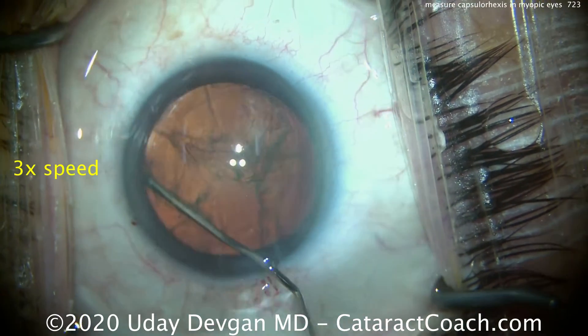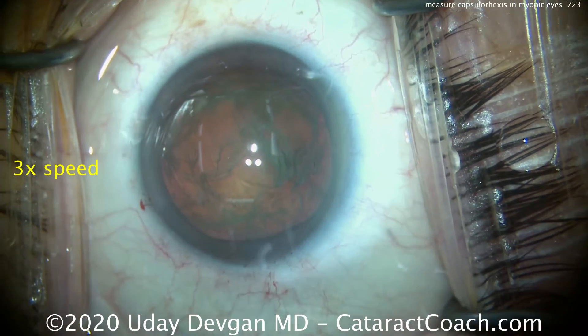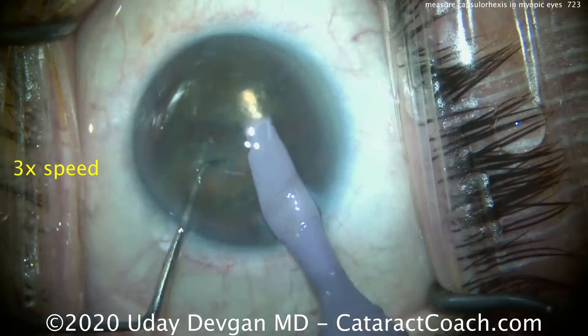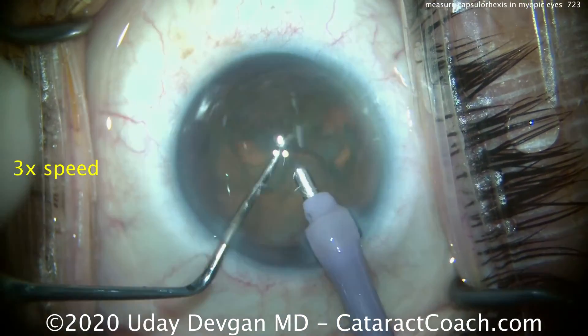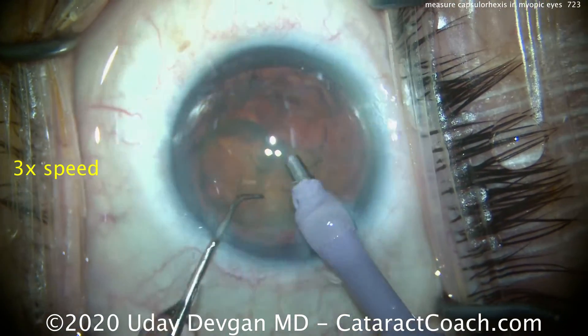We'll do some gentle hydrodissection here. We're going to speed up the video and show it at many times normal speed. There's the nucleus partially prolapsed up into the capsular bag. And then we're going to chop it and remove it, emulsify it quite easily. This is going to go very rapidly.